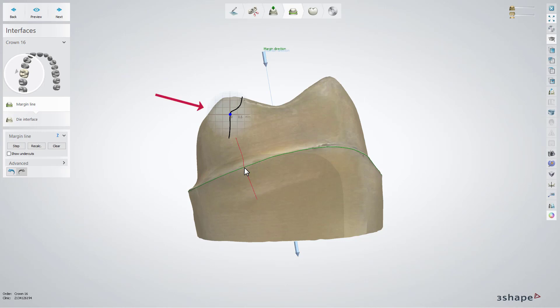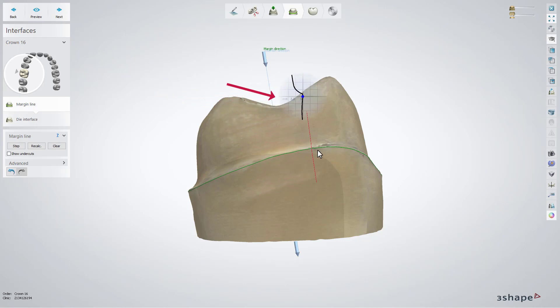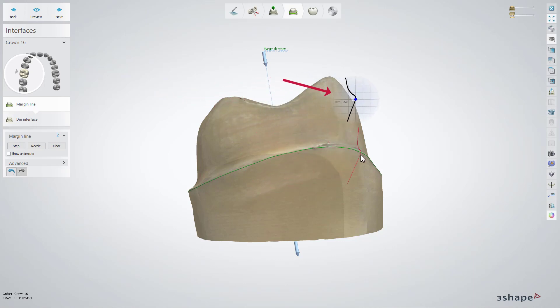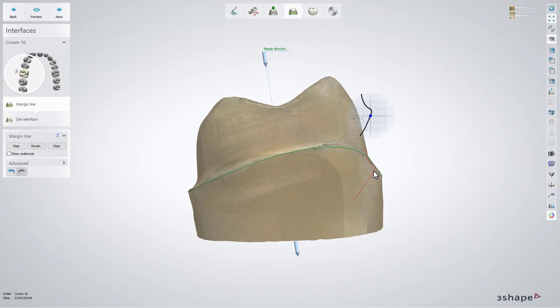The local cross-section tool is available to show the exact placement of the margin line. When the local cross-section is enabled, you can view it at one of the line points. A similar functionality is available when you click the Step button. Both increase the precision of the margin line placement.